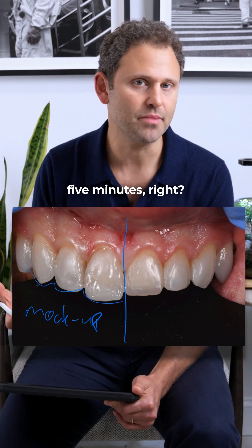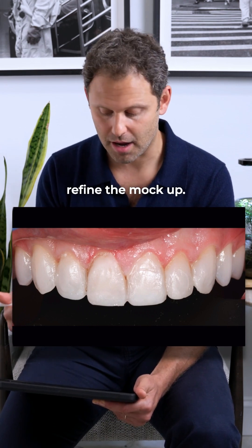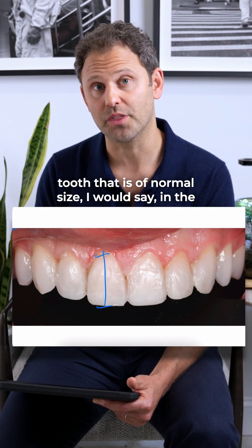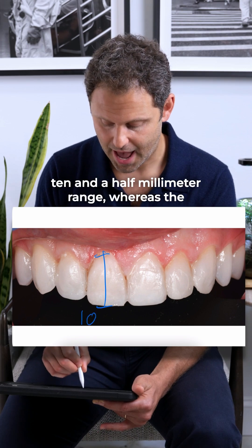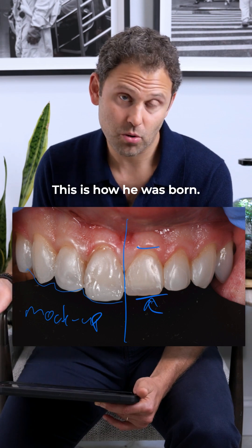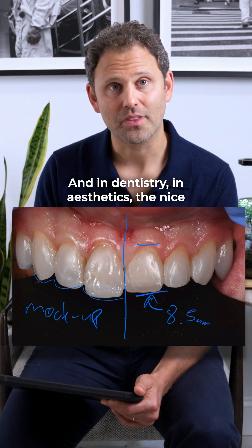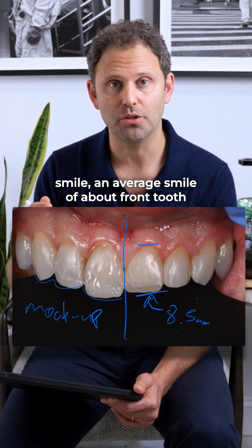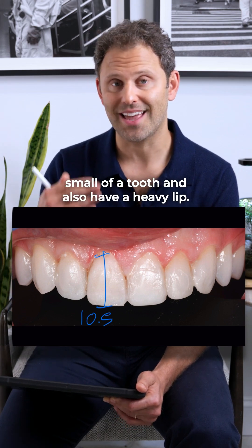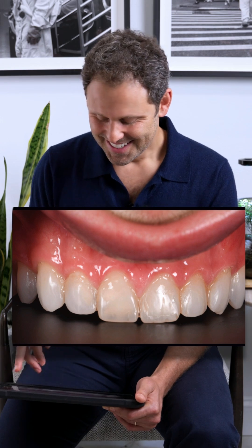This mock-up takes me about four or five minutes at the very beginning of the appointment before we get started. I then refine it, get the lengths I want, and take measurements. This gives us a tooth of normal size — in the 10.5 millimeter range — whereas the tooth he was born with was unfortunately in the 8.5 millimeter range. In aesthetic dentistry, an average front tooth is anywhere from 9.5 to 11 millimeters in length.